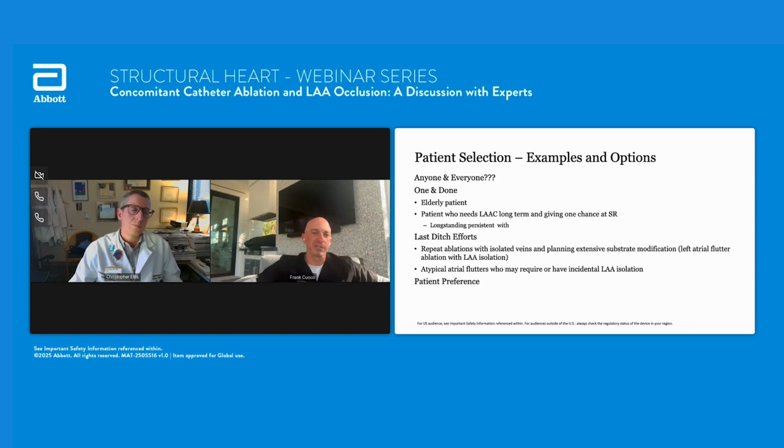I'll move on to the next slide because I just had some thoughts when I was asked to talk about patient selection. I'm sure this will open up questions to everyone. I'll talk about the patients I think about when I think about doing concomitant procedures. First and foremost, is it anyone and everyone? As we progress, a lot of our AF patients are thinking about both of these issues, and we're going to have to address this. But from a practical and workflow standpoint, we're not quite there for anyone and everyone yet.